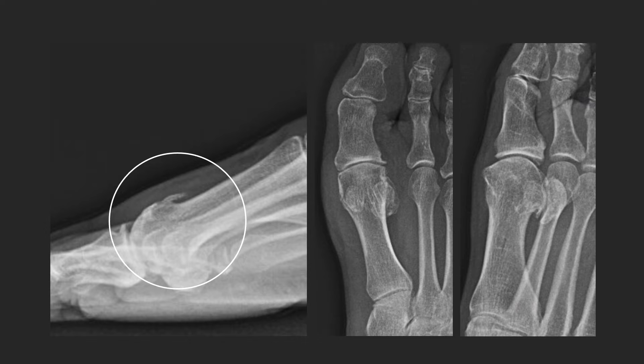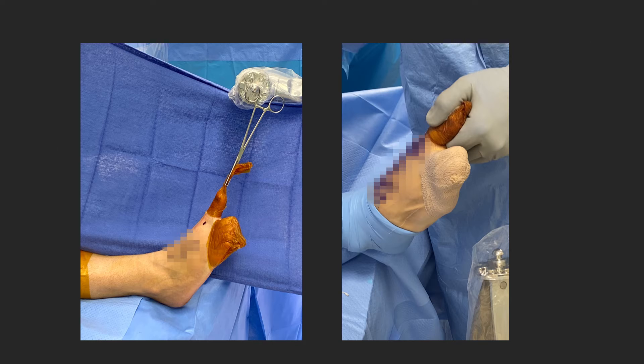So what do you offer this patient? You can offer her a fusion or a dorsal cheilectomy. But this patient wants to get back in the gym tomorrow — so why not an MIS dorsal cheilectomy? What does that look like?